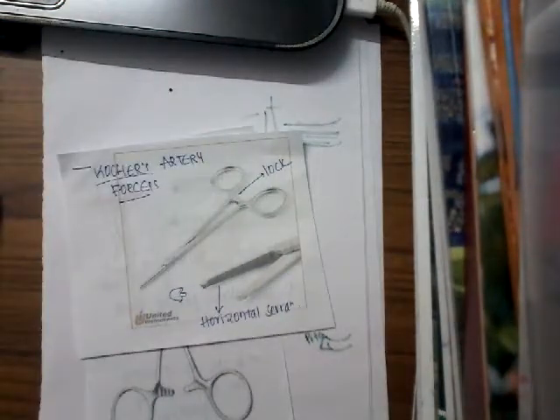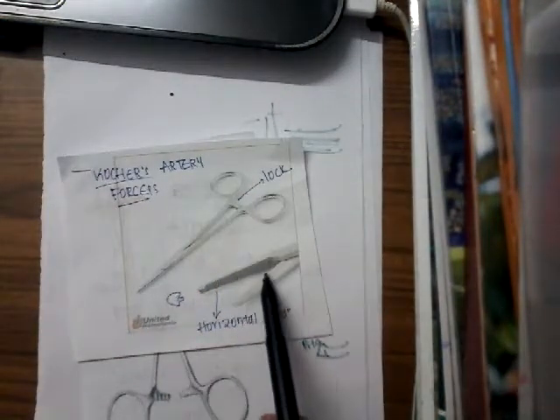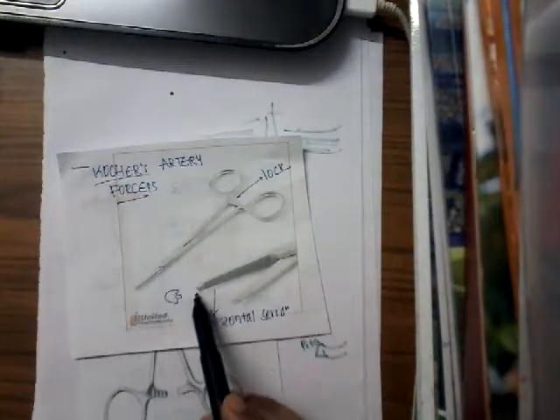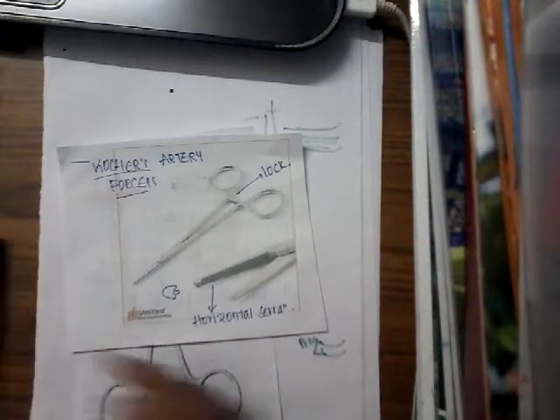There are many ways to identify. One, it has a lock — that is one thing. And then the second thing, it has horizontal serrations to the blades. If you see the blades, it has horizontal serrations and at the tip of the blade, you will have a tooth.